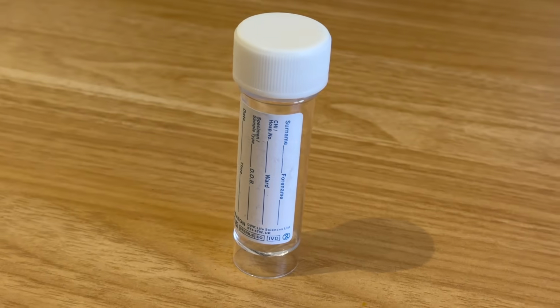In terms of doing it, we want to make sure we're covering ourselves, so we're making sure we're wearing gloves. We're going to provide the patient with a urine bottle and have them bring that sample back to us in an ideal situation. The reason being is the patient has given us that sample and then we have chain of custody and we can take it and get it assessed.